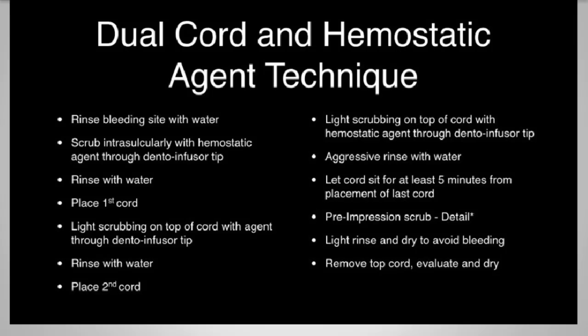Materials like Detail from Clinician's Choice, or there used to be a product called Prep Quick from Ultradent, can go in place and help clean the dentition off, almost leaving a surfactant across the dentition, allowing impression material to flow. It really kind of decreases surface tension. We go ahead and remove that top cord and introduce our impression material.